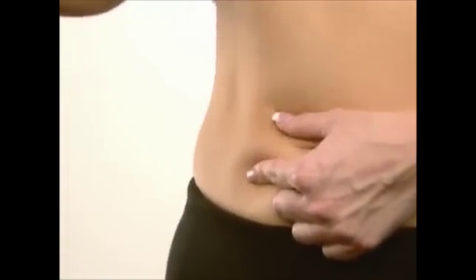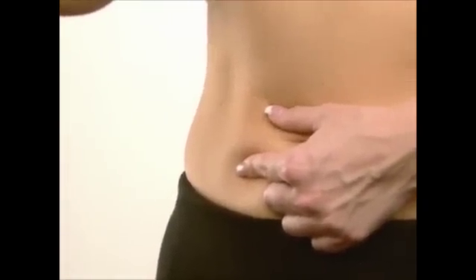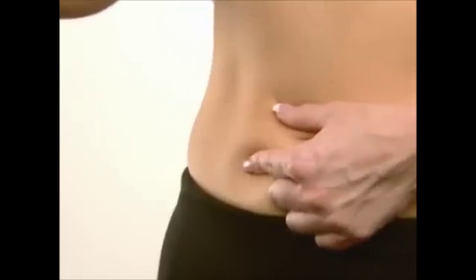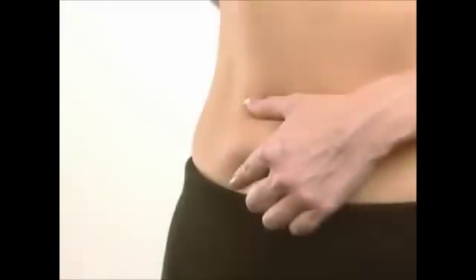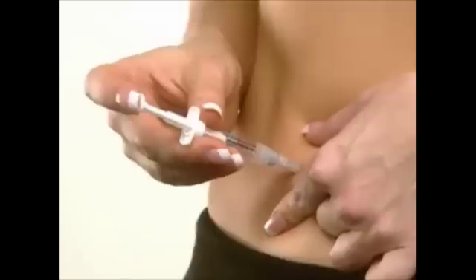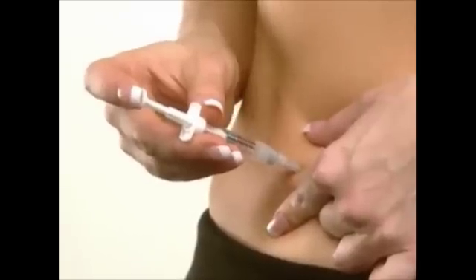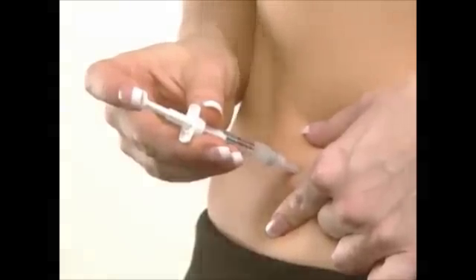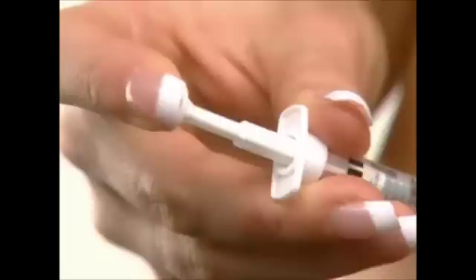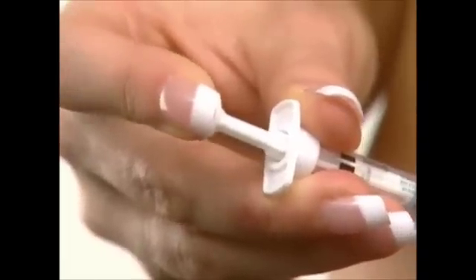Hold the syringe with one hand the way you would hold a pencil and pinch the skin on the chosen injection site with the other hand. Insert the entire length of the needle into the skin at an upward angle of about 45 to 90 degrees as indicated by your doctor or nurse. Release the hand pinching the skin and depress the plunger in a slow steady motion until all the medication is injected.